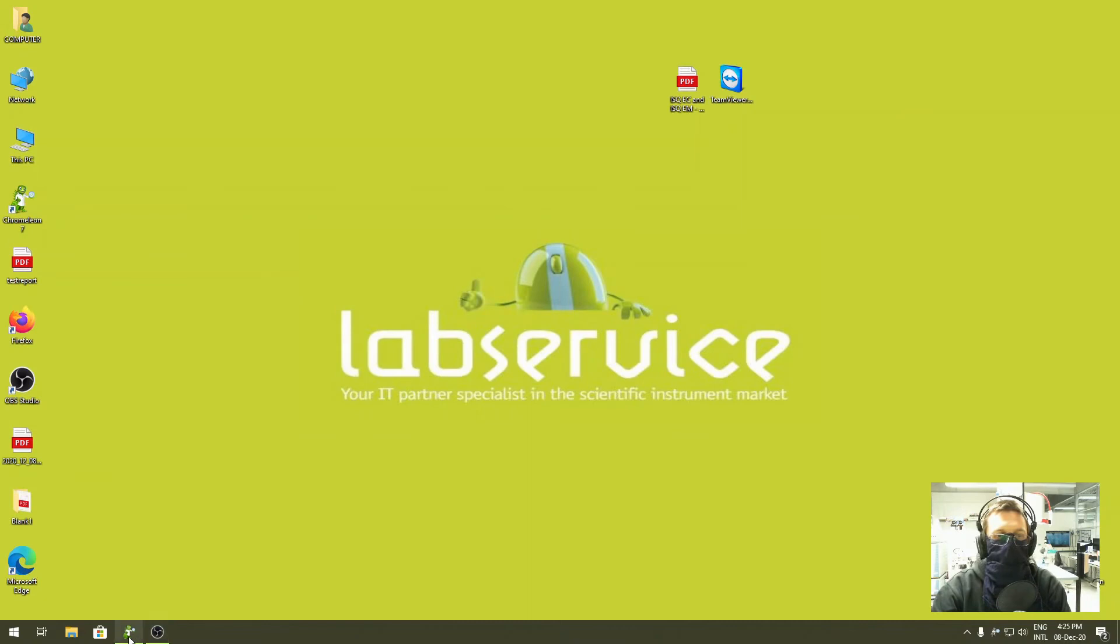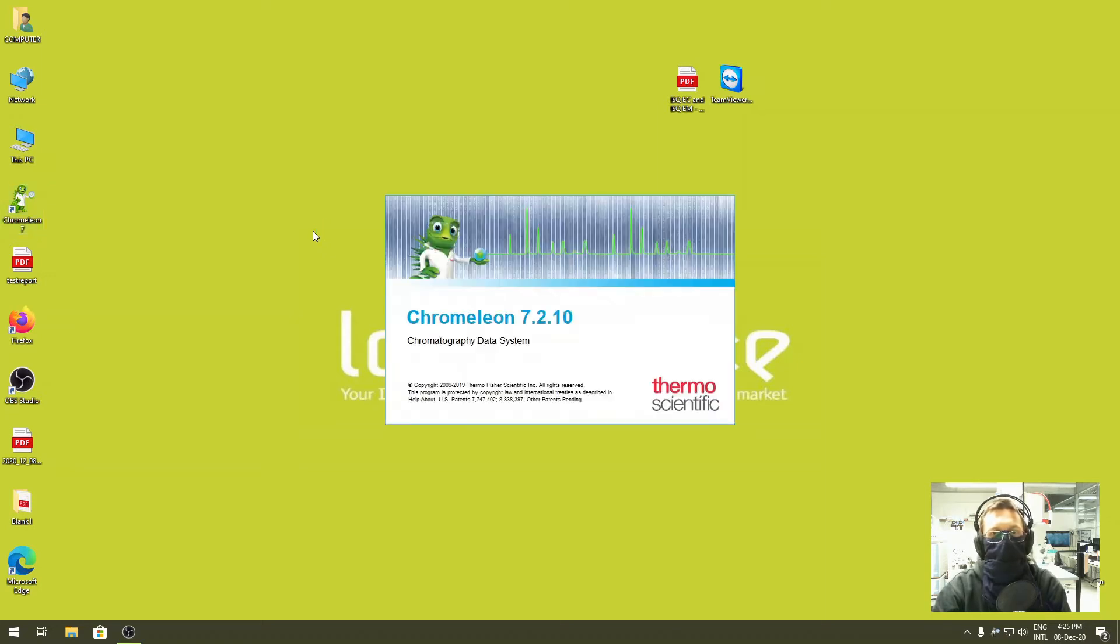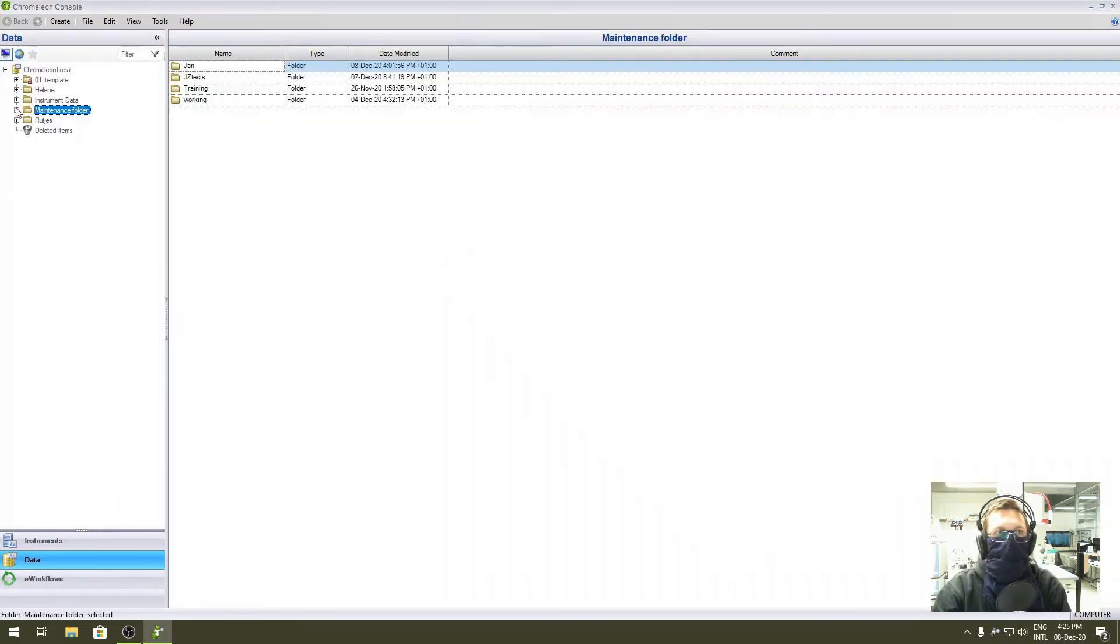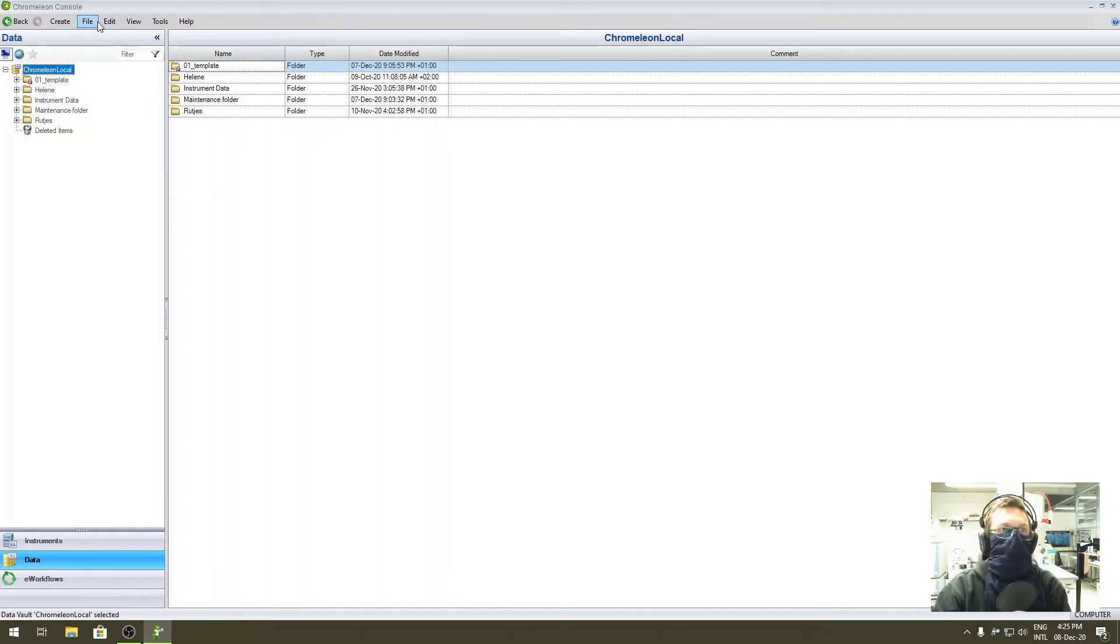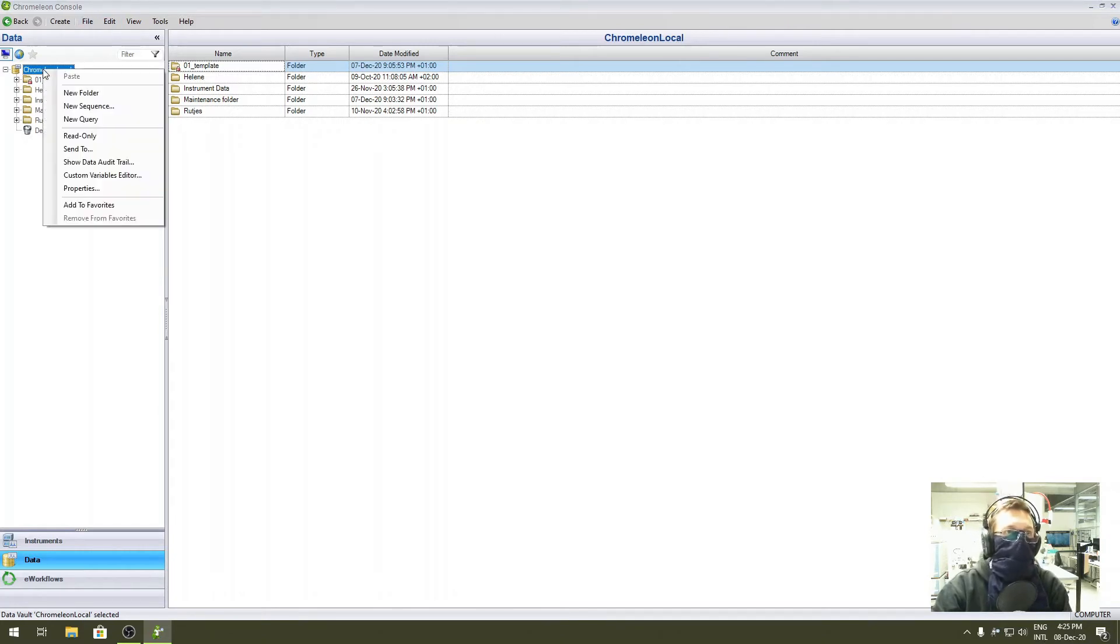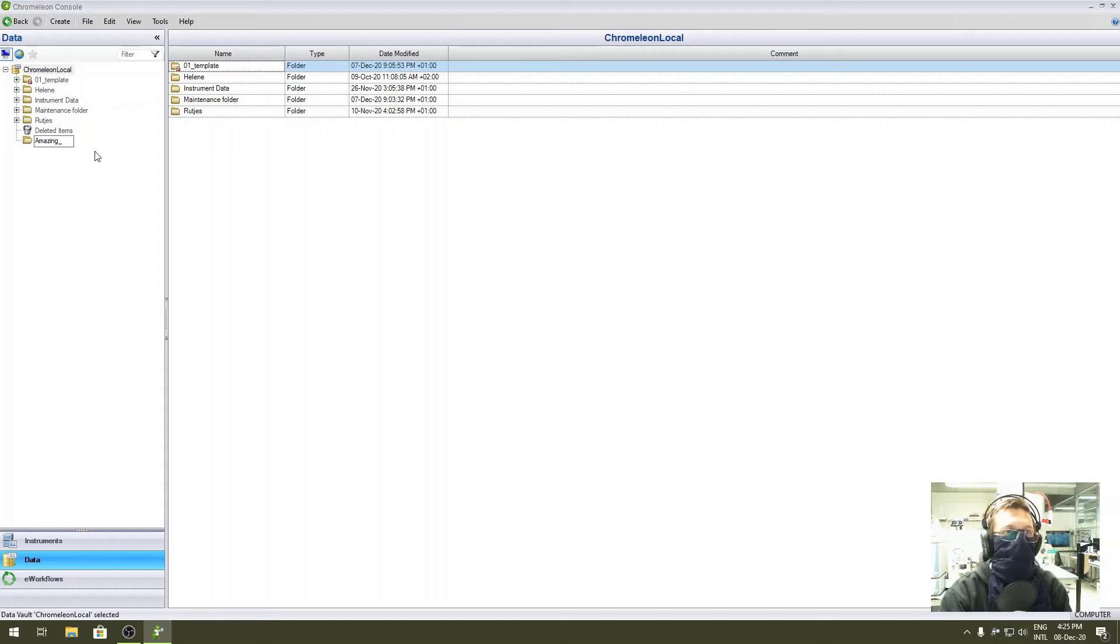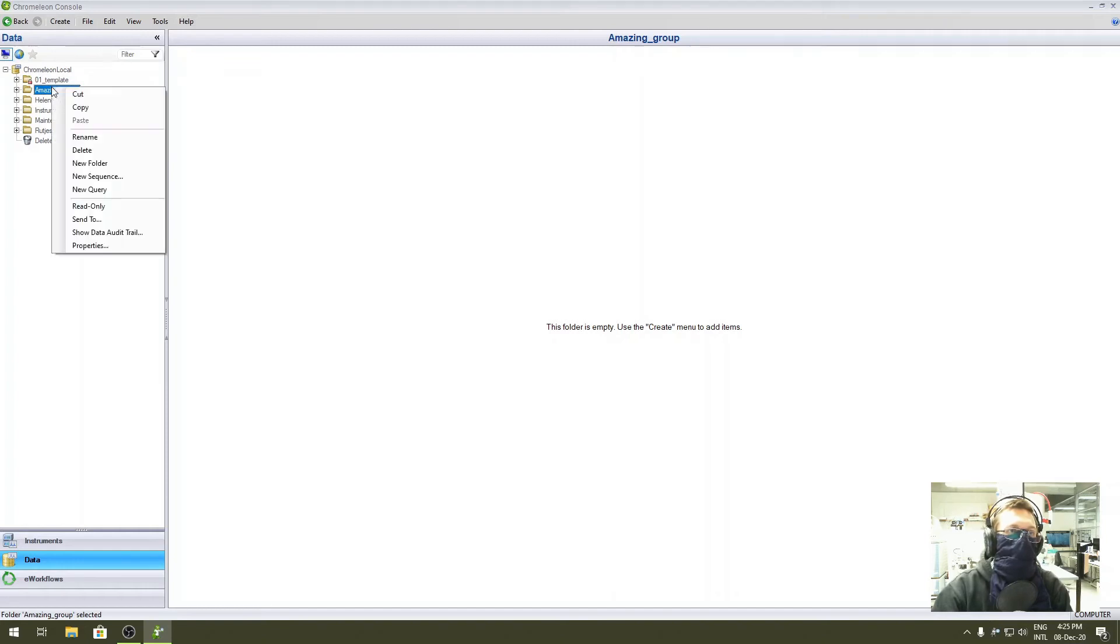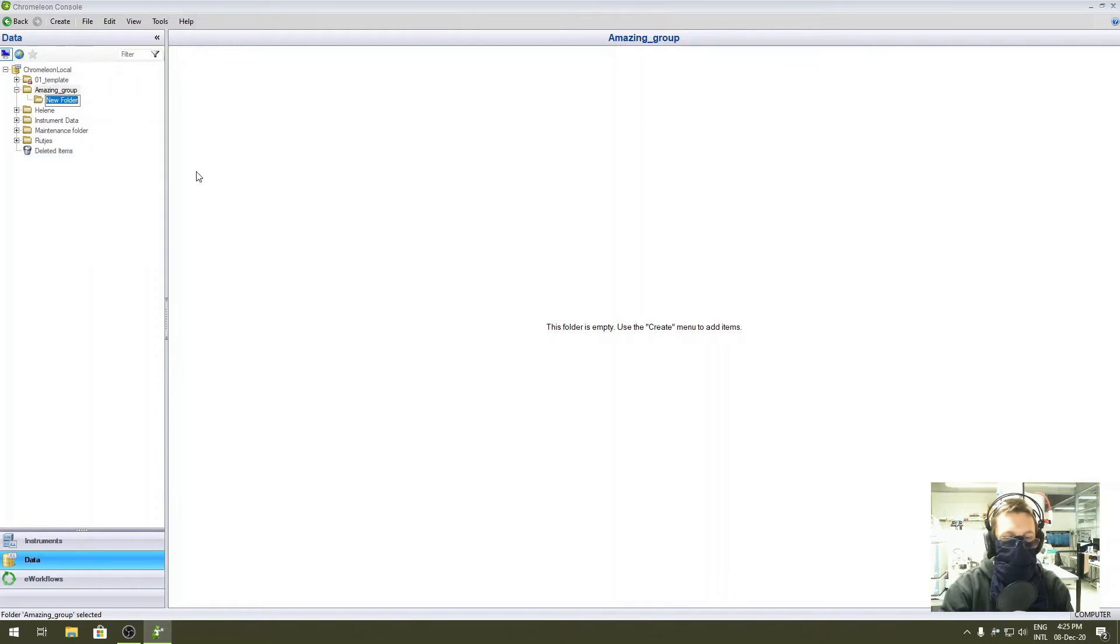Once you put your samples into the machine, it's time to start Chromeleon and submit the samples. So you start Chromeleon, wait for a short while. If it's the first time you're using the machine, you need to create a folder. If you're the first from your group, create a folder for the group. New folder - you're part of the amazing group. Next, create your personal folder: right-click, new folder, John Doe in my case.